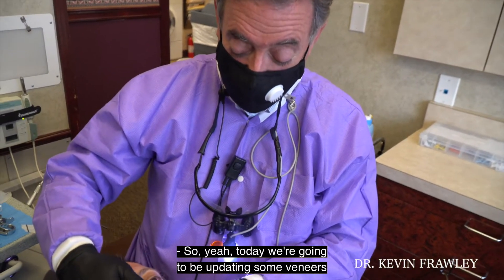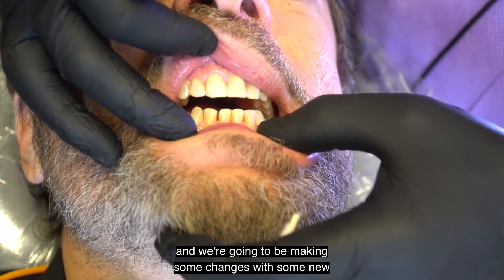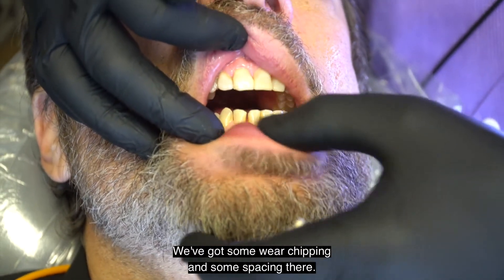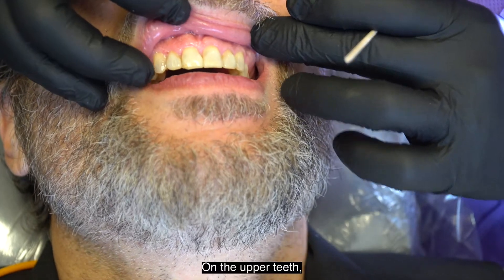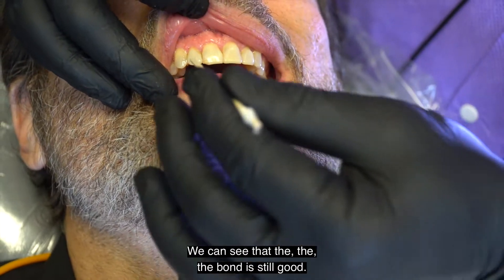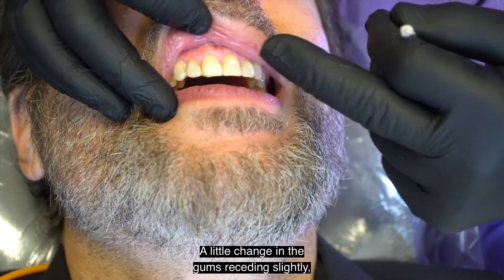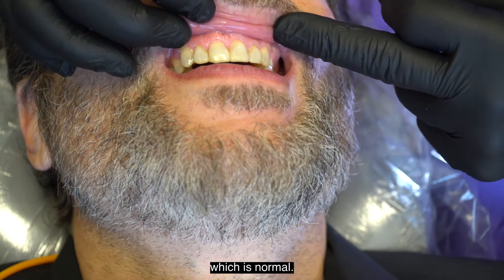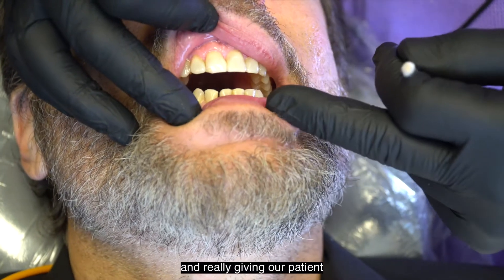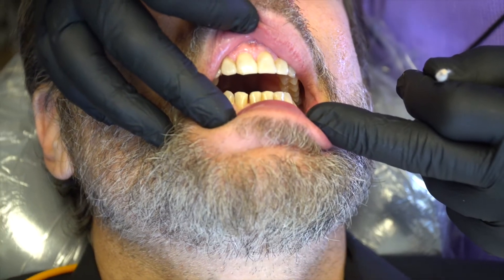Today we're going to be updating some veneers on the top and making some changes with new veneers on the lower front teeth. We've got some wear, chipping, and spacing there. The upper teeth have a little chip here and there. These were veneers done 13 years ago — the bond is still good, we've got nice tissue response, there's been a little change in the gums which is normal, and we just have some wear and tear. So we're going to be updating those and really giving our patient a great smile on the lower as well.